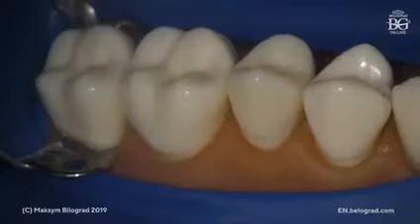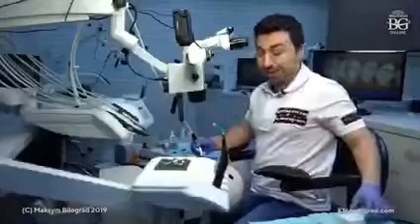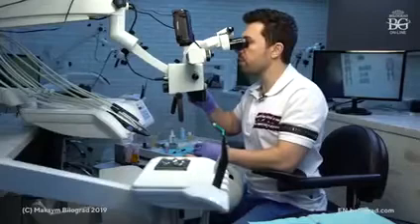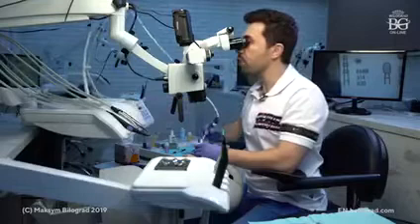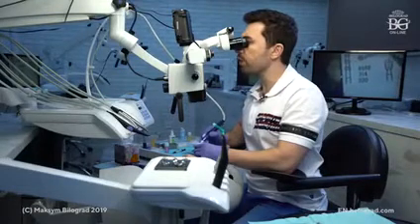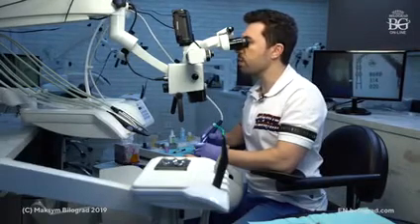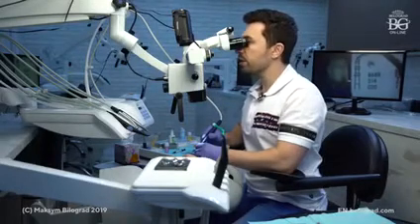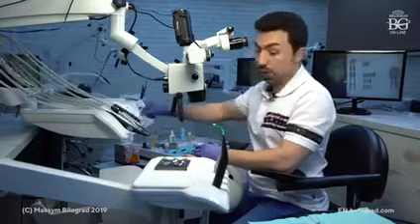We have already inserted the depth cutter. This depth cutter that I'm using is from our burr set. Let me give you a reference number of this burr, this one that has a depth of 0.4. The ledge here is 0.4. This is the number of the burr, so this is 0.4. The good thing about this burr is also that the tip here is 1.5 millimeters. This tip can be utilized as a depth cutter for the occlusal surface, for example.